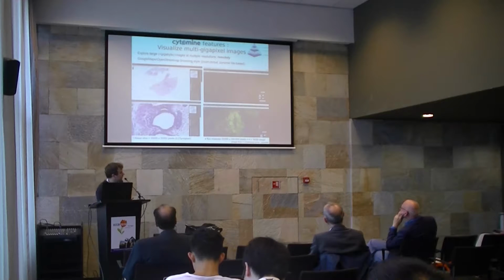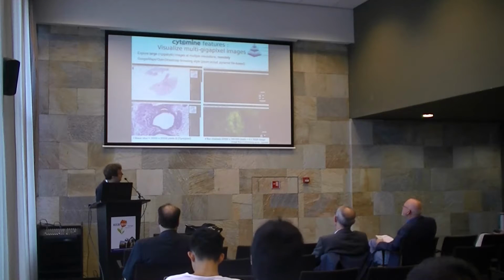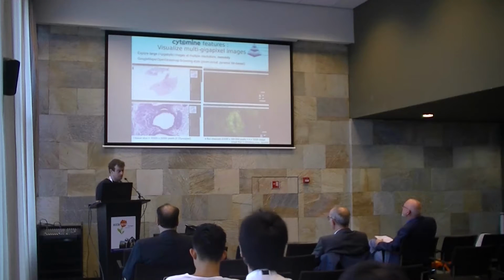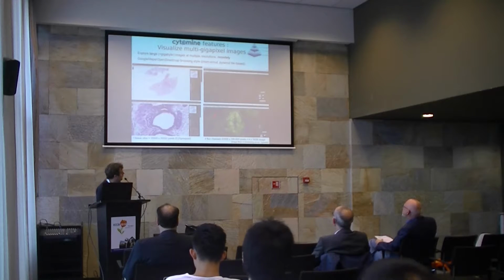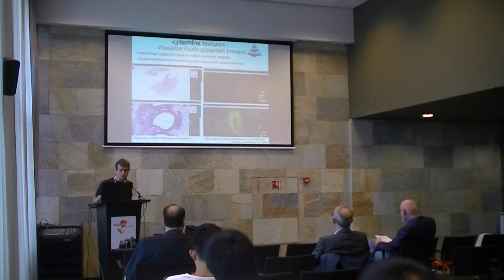So as I said, the software allows you to visualize very large images that are produced by the digital scanners. So you have here the main explore view of the software. You see here the thumbnail of the image, and you can zoom in and zoom out in the image, and only the parts of the images that are visualized are transferred through the network. And so we support very large images. There is no theoretical limitation to the size of these images that you can transfer through the web.